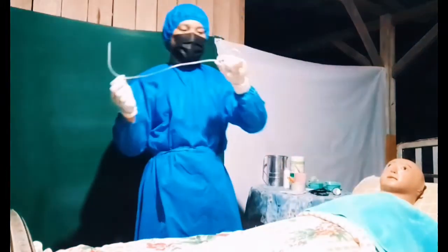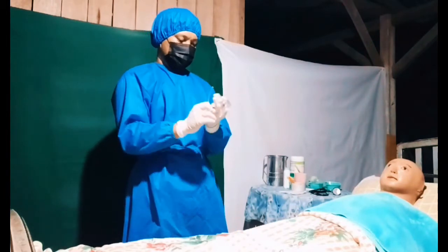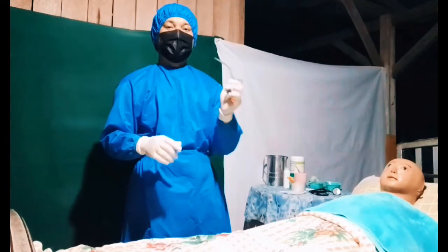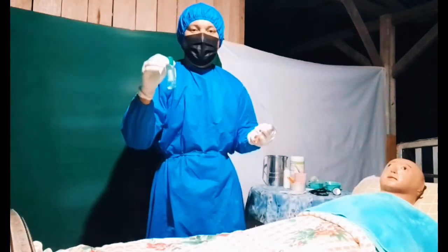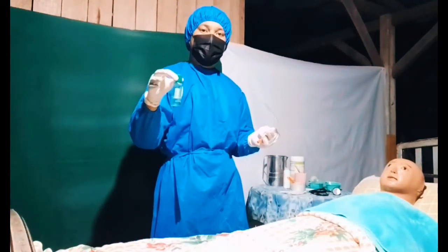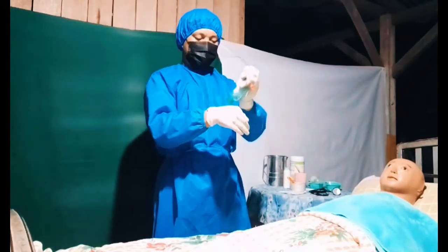So the mark is right here. Lubricate the tip of the tube from 2 inches to 3 inches. So, assuming that this is a KY jelly, a water-based lubricant, put it right here.